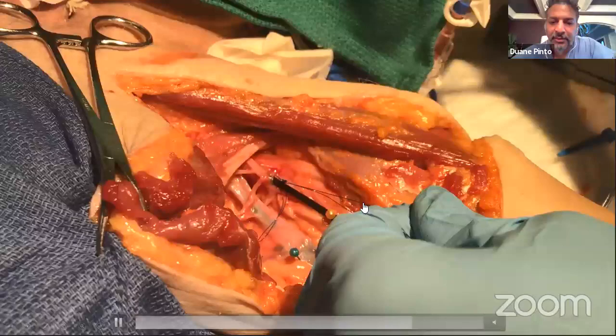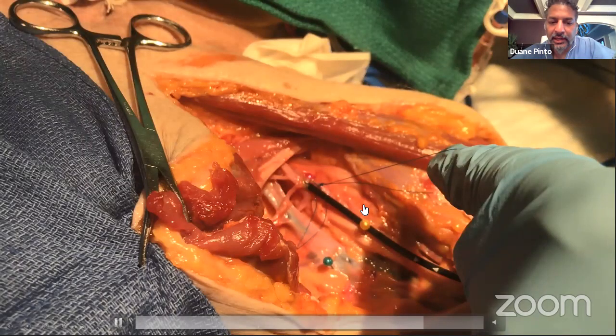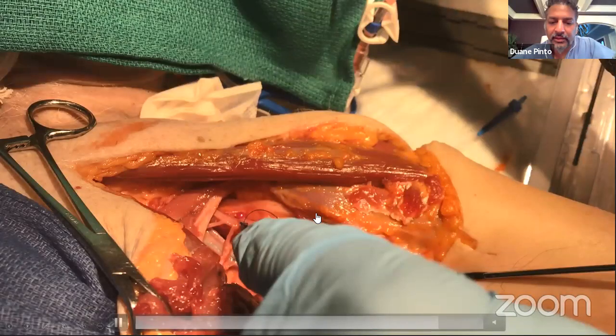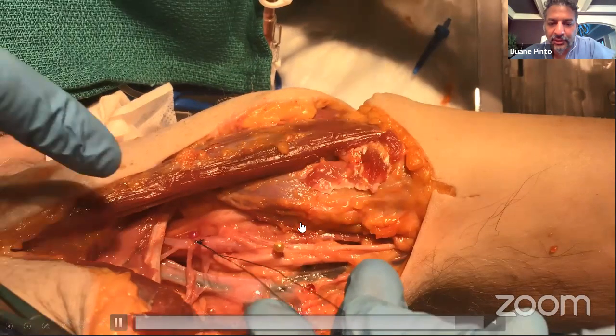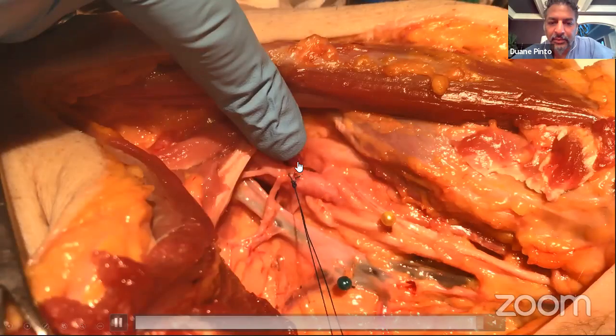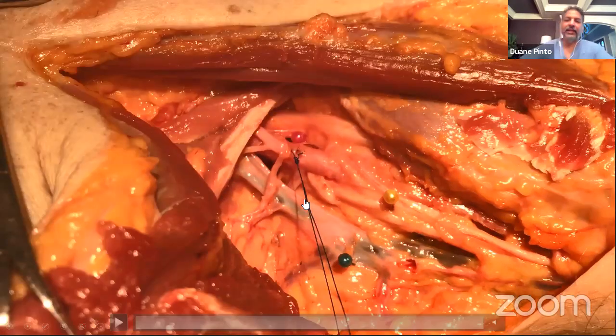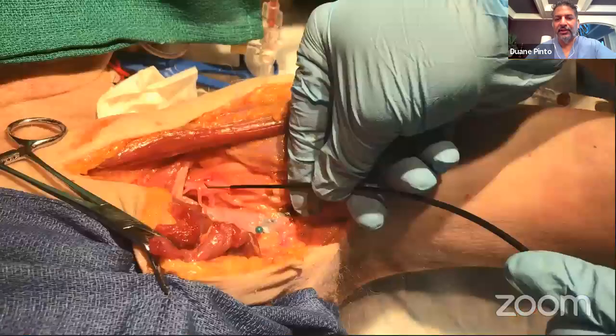And to remind you, the long blue one is the one that's the rail, and the white one is the locking suture. And you see there's a loop around the arteriotomy with the needle, with the knot down, and that will be enlarged with the larger access or tightened down at the end of the case. This is just another view of it.